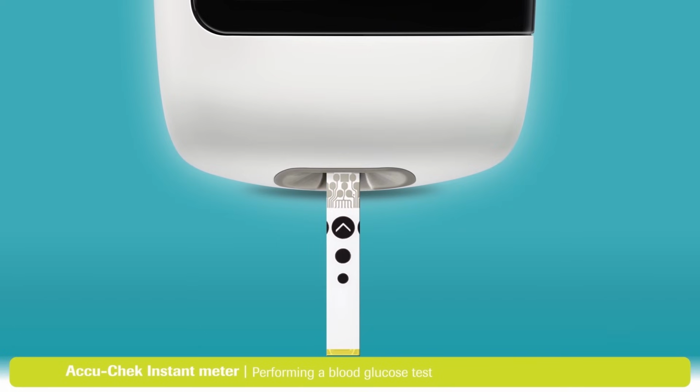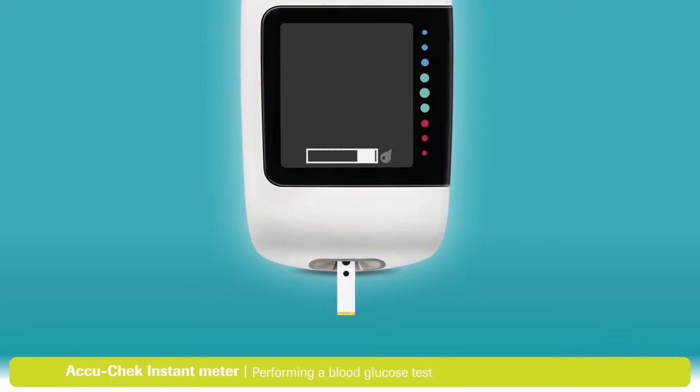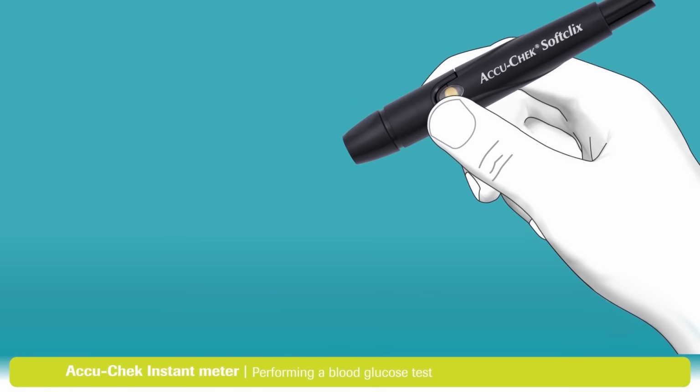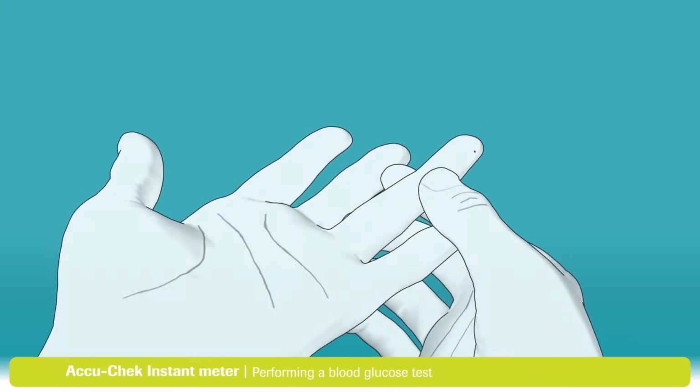Insert a fresh test strip, metallic end first, into the meter. The arrow in the black circle indicates the right direction. The meter will turn on automatically. A flashing blood drop symbol appears on the display. Now it's time to use the lancing device. Place the pinhole opening firmly against your finger and press the yellow release button. This will lance your finger.